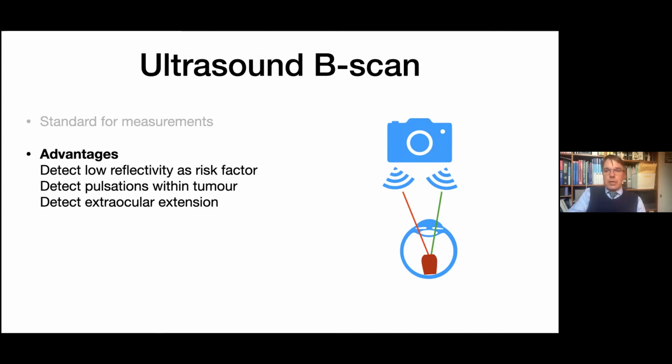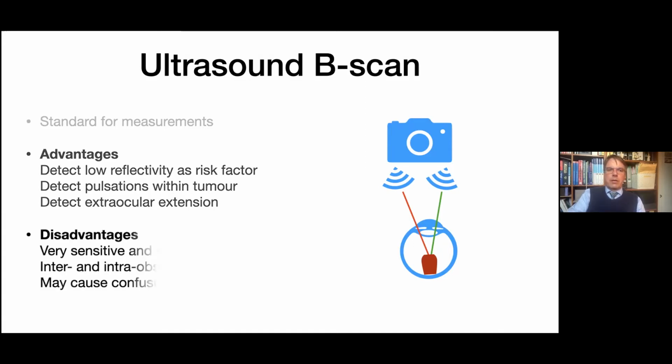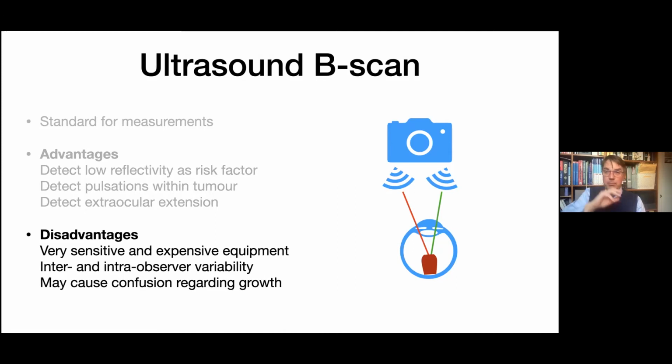I'm sure you know that one of the fears of every patient is, does the melanoma grow out the back of the eye where nobody can see? I understand you can see it in the front of the eye, but what if it grows into my brain? Now, they hardly ever do it, but sometimes they have an encapsulated extension at the back of the eye, and we can only pick that up with ultrasound, with no other imaging methods. So it's another advantage. There are some disadvantages.